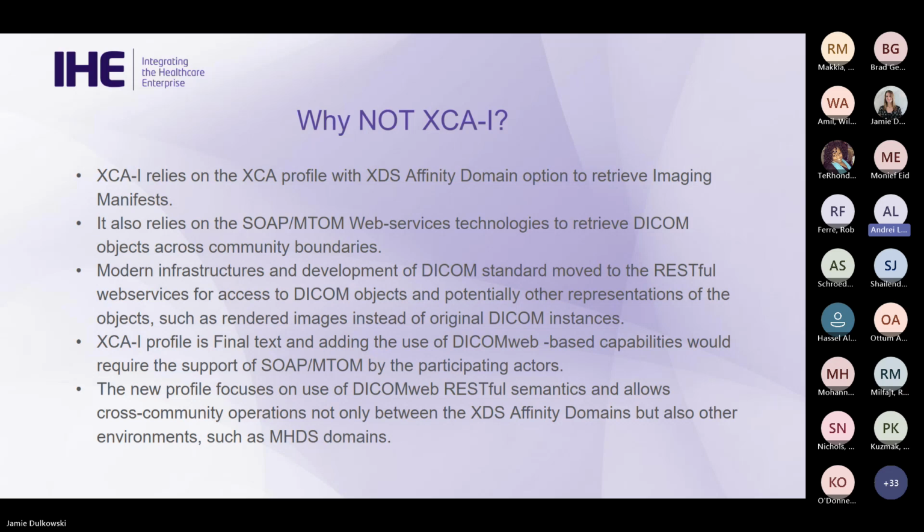Least important, but still the fact of life is that the XCAI profile is final text, and adding the use of DICOM web-based capabilities would require support of outdated technologies by the participating actors. And some of the implementers who are coming to the market and are interested in serving the needs which have been described earlier may not necessarily be keen to implement older technologies.